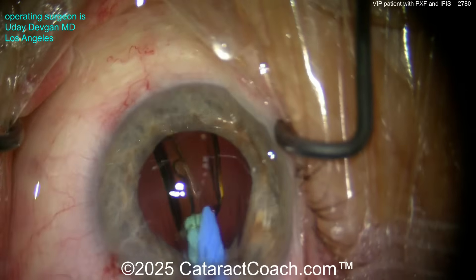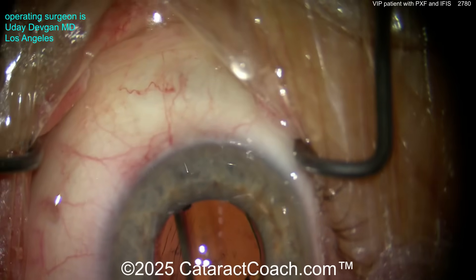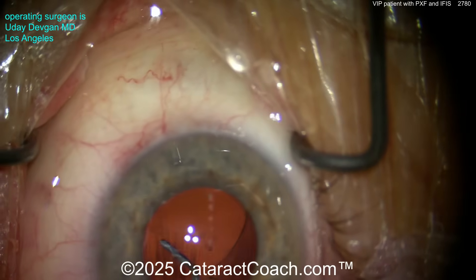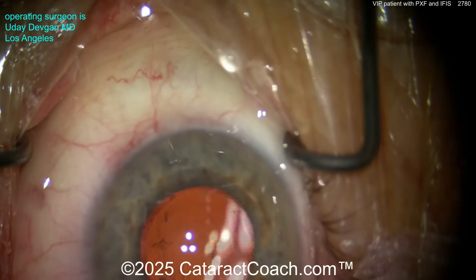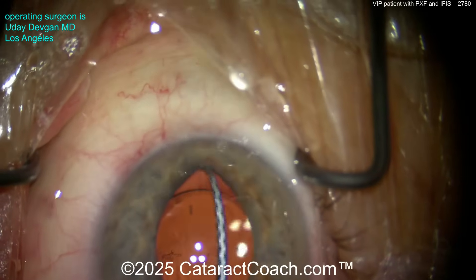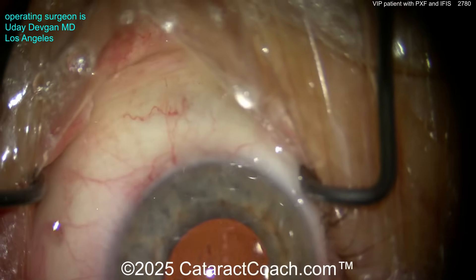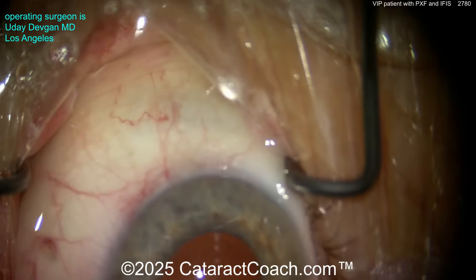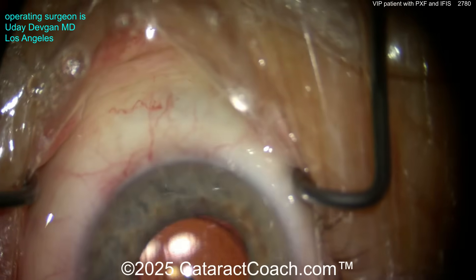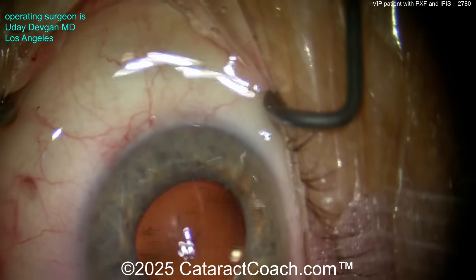Here comes the patient's lens — it's a single-piece monofocal acrylic lens going into the capsular bag. Now look at the capsular bag — a little bit of wrinkling there. There's some zonulopathy here; it's relatively mild but it's present. Again, the patient has pseudoexfoliation — you're not going to undo decades of pseudoexfoliation. Let's lift up the iris and check that the IOL is completely in the capsular bag and that there's no cortex remaining at the capsular bag equator. That looks great, so I think we're good.